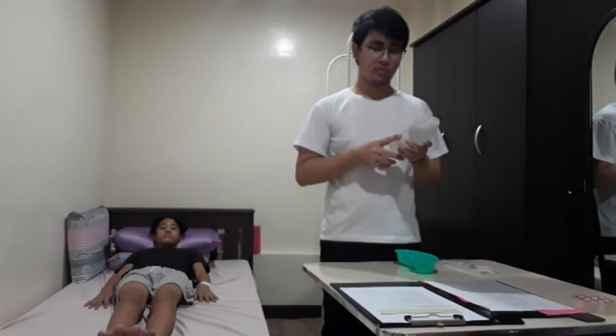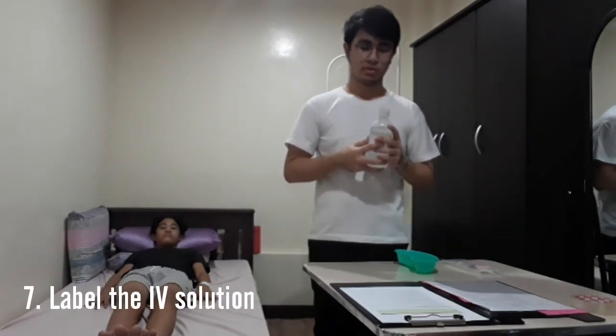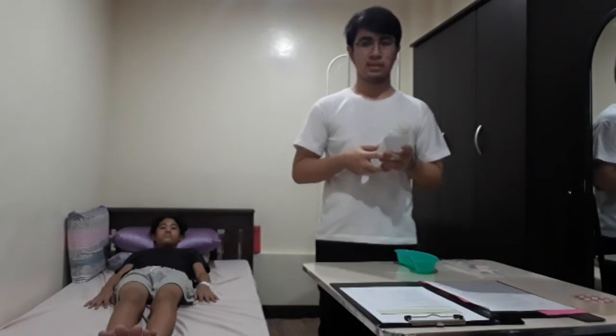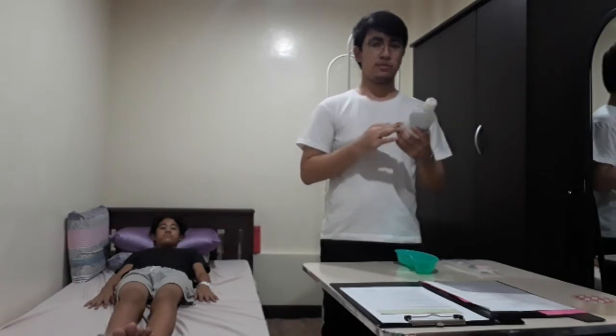Then after checking, we will now label the IV solution with the patient's name, solution type, amount, additives, rate of flow, date, time of start, and expected consumption using the agency tag. So I have pasted the tag here, so I will just write the necessary information.